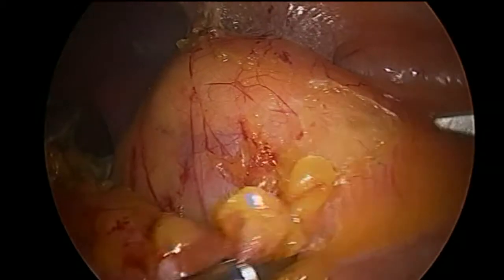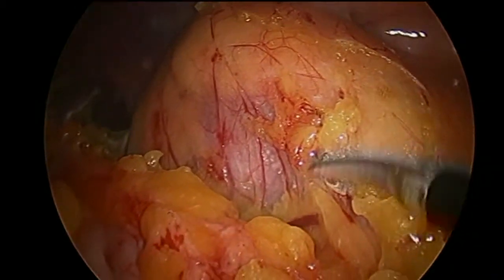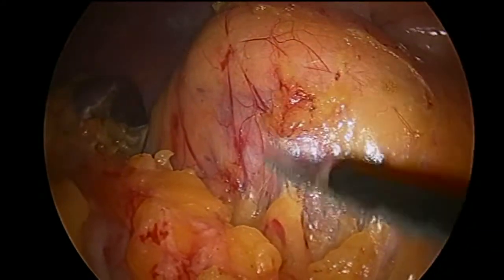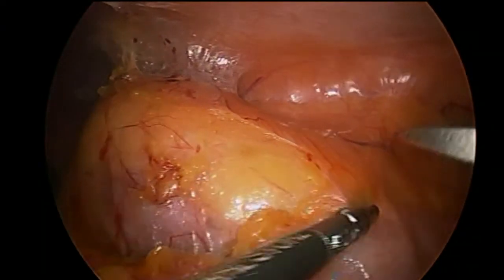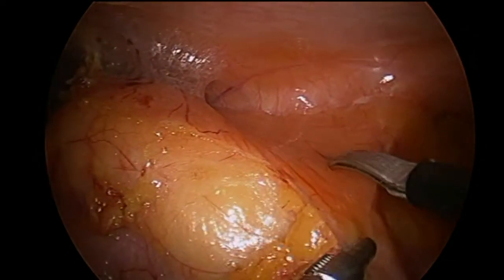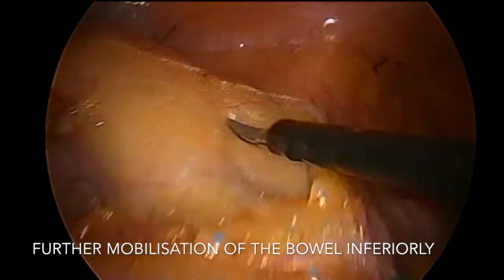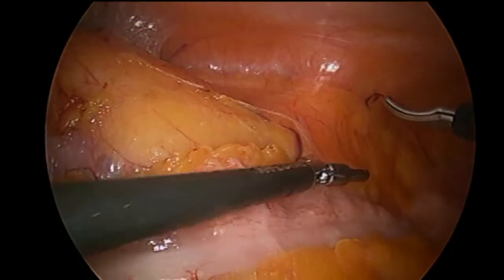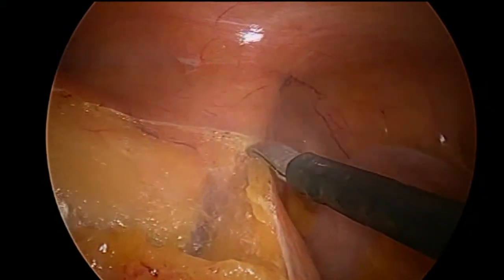That's actually the hardest part of a left nephrectomy — to get the upper pole freed. Here we have the continuing mobilization of the bowel, again with some good traction using a grasper and making sure that we stay in the right plane. This is an avascular plane if you're actually in the correct part. This plane is often a bit different when it's a nephroureterectomy for urothelial carcinoma, as there's often a desmoplastic reaction and it may not open up as cleanly.